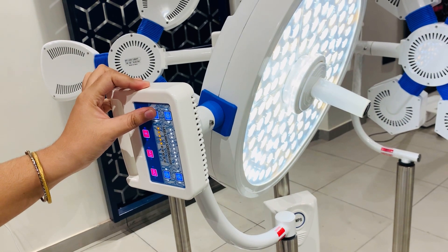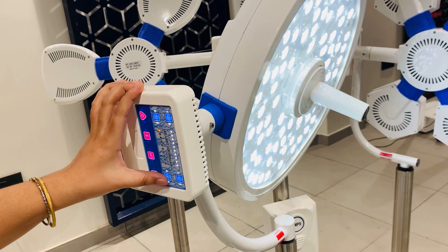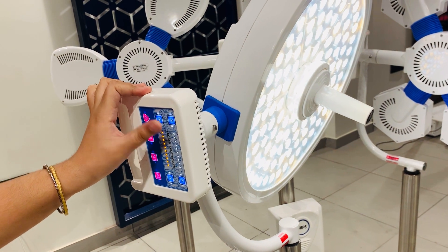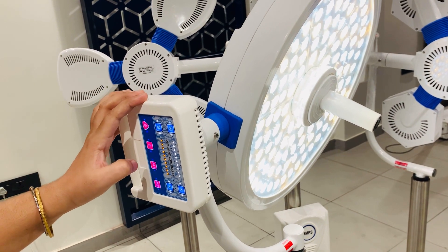From here the yellow light will be decreased, and from here the yellow light will be increased. Both the white light and yellow light can be increased in 10 steps.